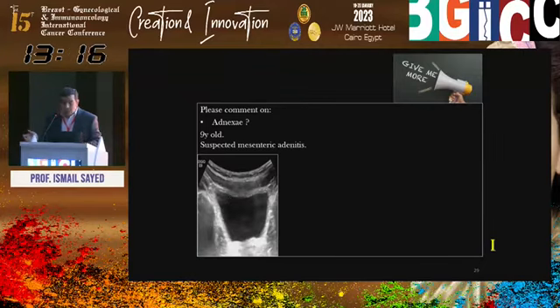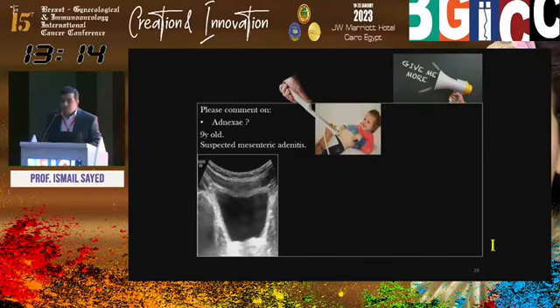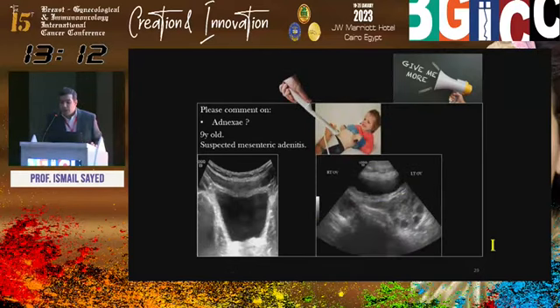No problem. Transvaginal transducer on the abdominal wall. You see, it's, by the way, microconvex. Small right-sided ovary, this is normal for age, and the left is enlarged. Enlargement and ovarian edema is the most important single sign in ovarian torsion, if it doesn't contain any mass or cyst. But if it contains a mass or cyst, it is in an abnormal location.